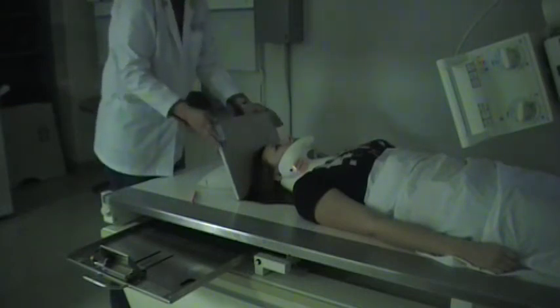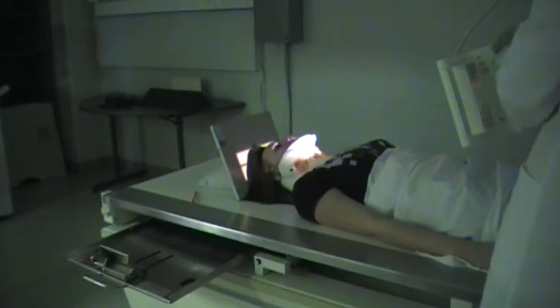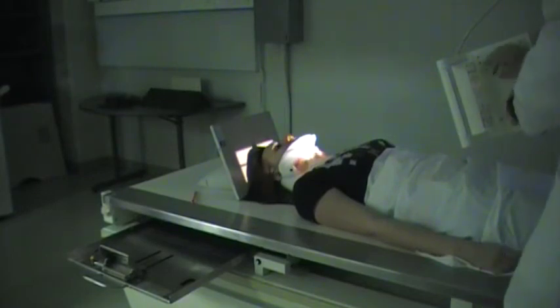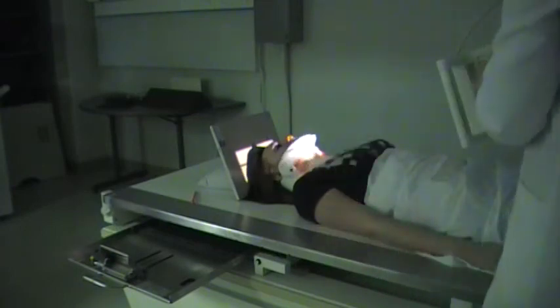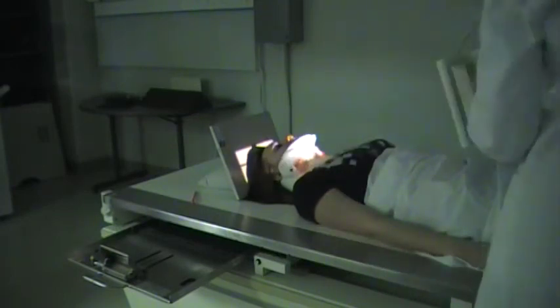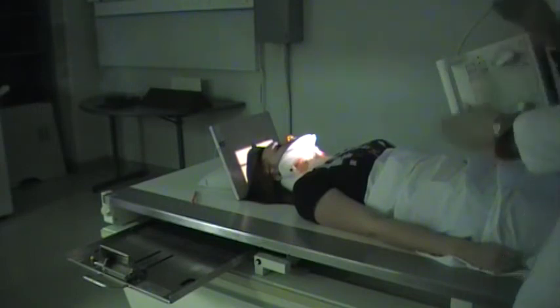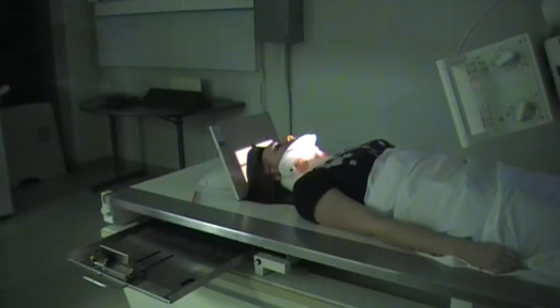Okay. Now we can collimate in so that we don't need a very large area on this, because with the arches we're just wanting this area right here. So I like to collimate where you can, it's like you're cutting off the tip of the nose there, but have it open enough that both sides of the face are included. So that is our SMV.